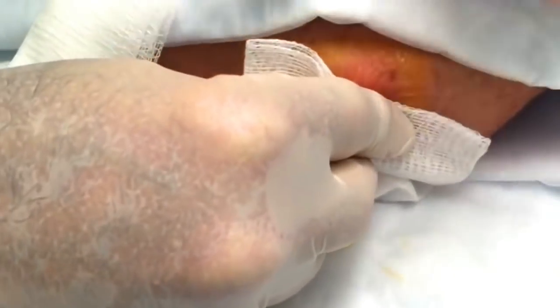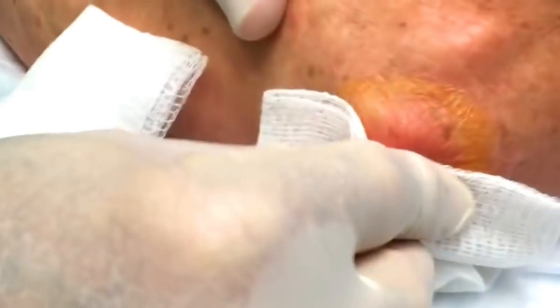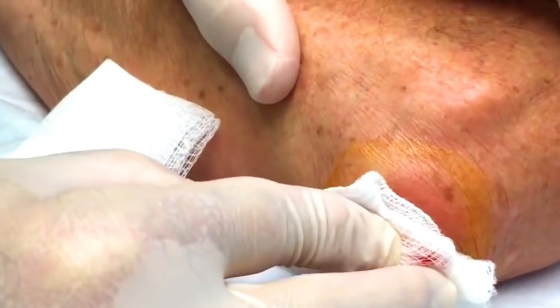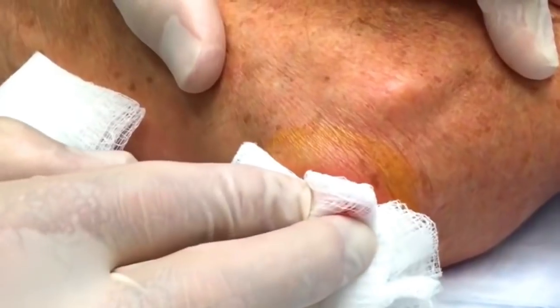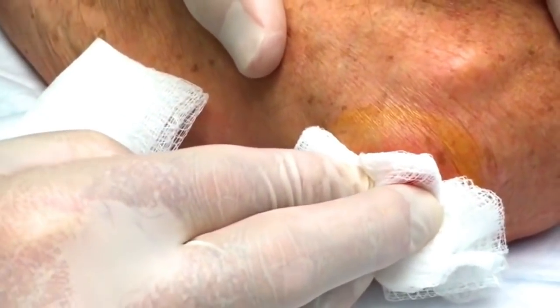Good. I'm going to set that right there. Good. I think we got the fluid out. This is olecranon bursitis is what this is. And the fluid is just a byproduct of the inflammation. So we put a little cortisone in after we pulled the major part of the fluid out. And now what we're going to do is we're just going to wrap this. And we're going to put our patient on an anti-inflammatory. And he should do just fine.